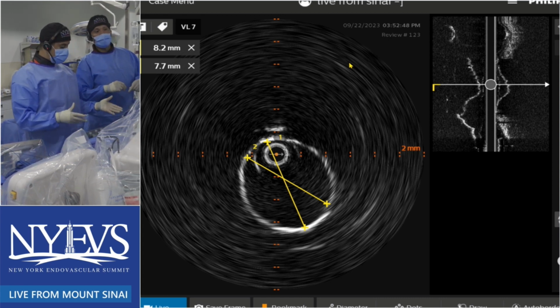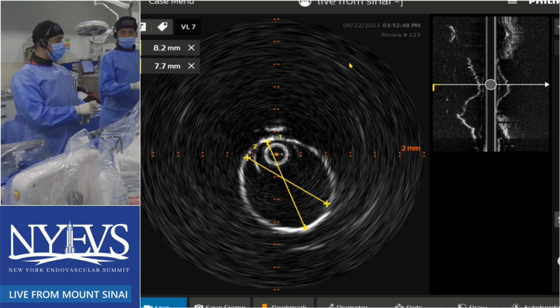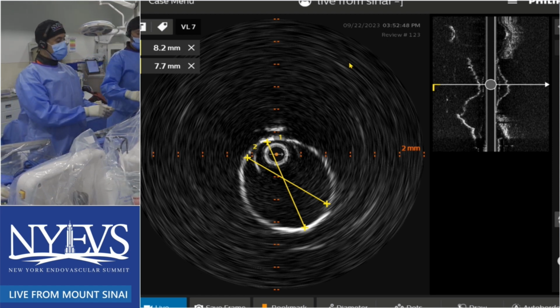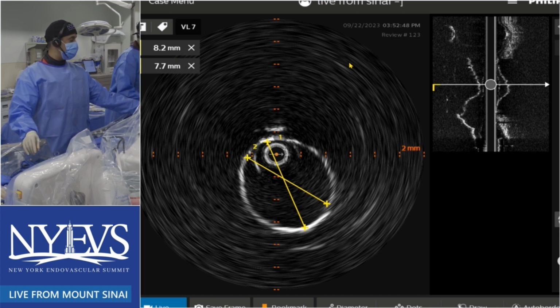It was 6.9. So again, the IVUS really helped us in the case in regards to the calcification, the sizing, of course, and like you rightly said, regarding the stent implantation to see we have good results. Go live on the IVUS after that. We're just going to quickly go on the left side.